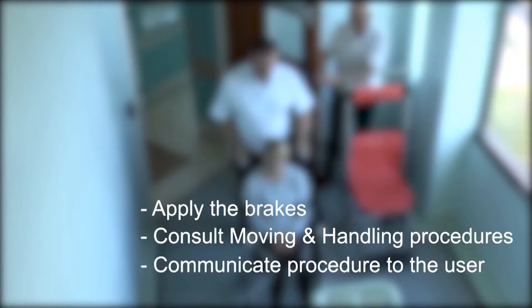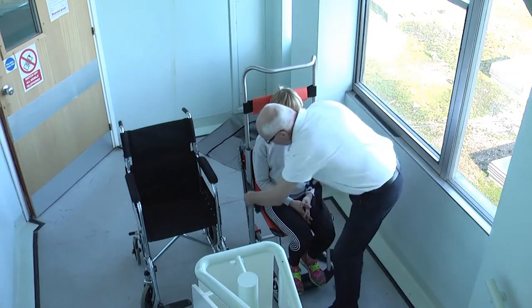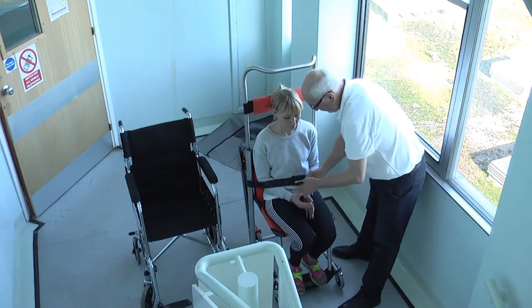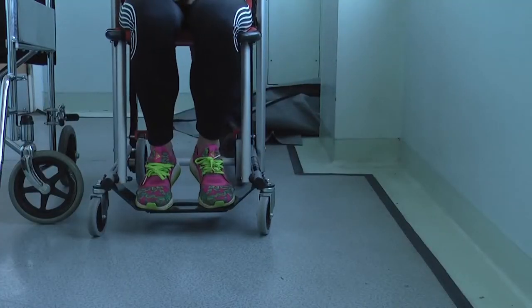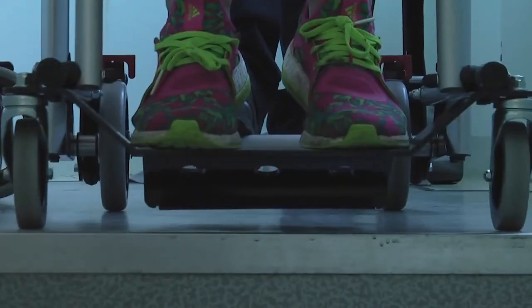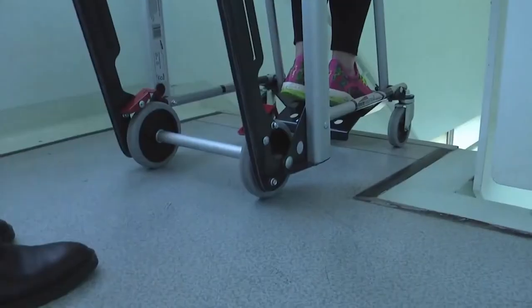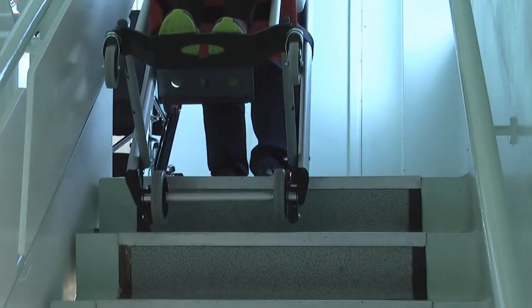Communicate the procedure with the user before moving down the stairs. Ensure the user's feet are placed on the footrest, then fasten the seatbelt around the user with their arms inside. Adjust the height of the headband to ensure the user's head is fully supported during the stair descent. Remove the brakes and proceed to the top of the stairs, stopping approximately 10cm from the top step. The Versa Evacuation Chair's top step safety feature will prevent the chair from going too far over the top stair.